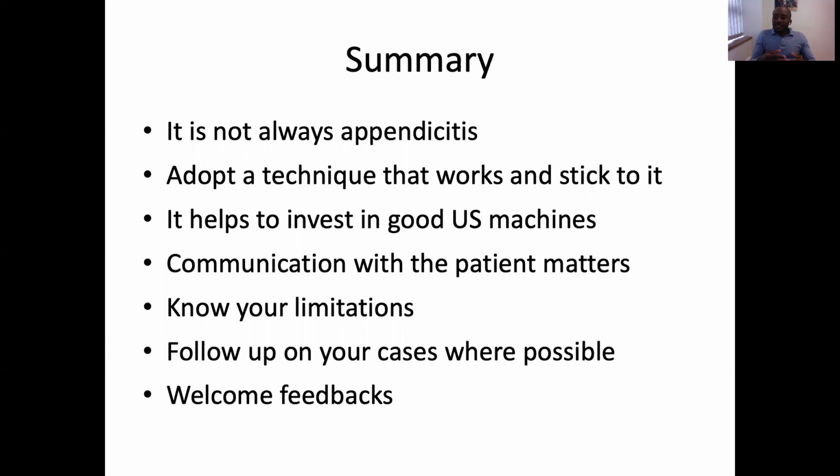If you're scanning kids, just play with them. Like, oh, the video game. Would you like to use my video game joystick to point at where your pain is, or something like that? And they're like, oh yeah, just there. And they're like, okay, let's have a look. I look up on the screen. You check, and you usually try to find where the patient says. Sometimes they tell you it's there. And in that case, you have to look everywhere around.